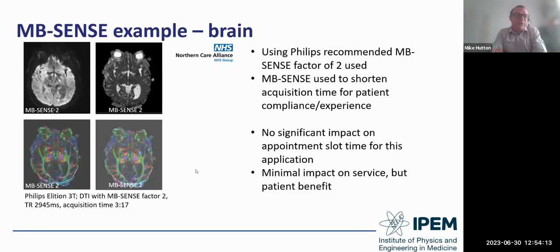These acquisitions can obviously be very long at times, so 3 minutes is pretty good for a DTI acquisition. There's no real significant impact from this technique, given how infrequently it will be used, even in a neurocenter. Minimal impact on service, but some patient benefits there.